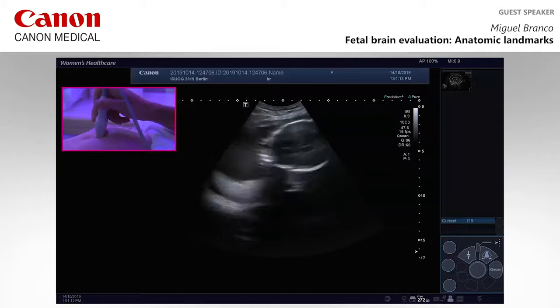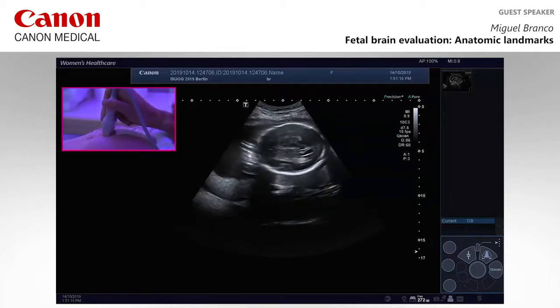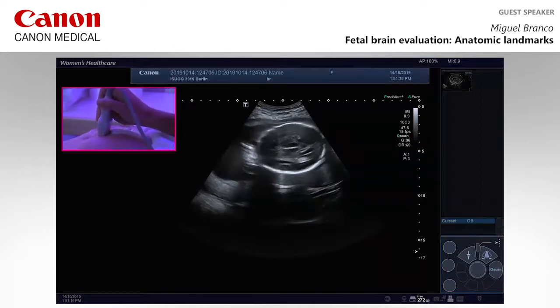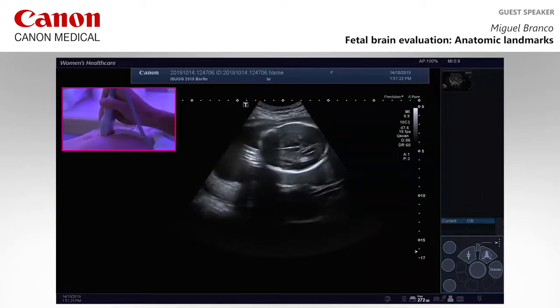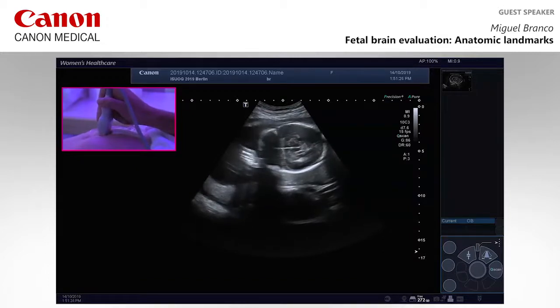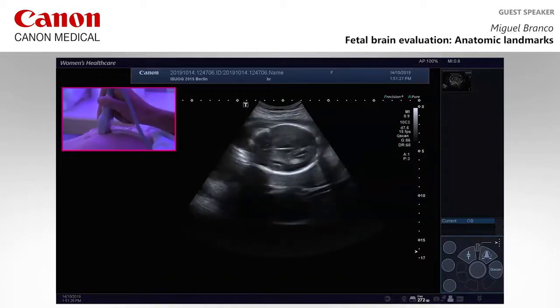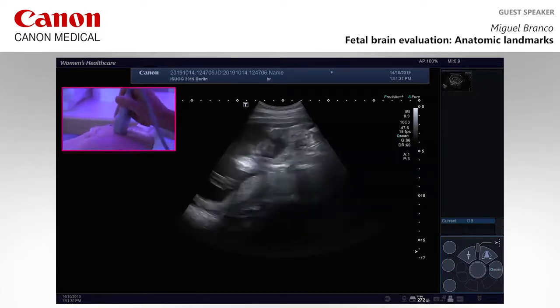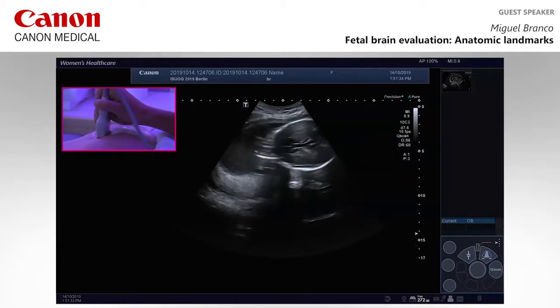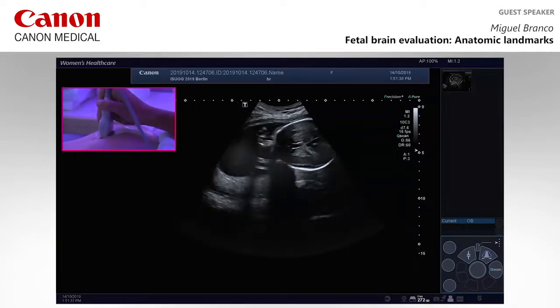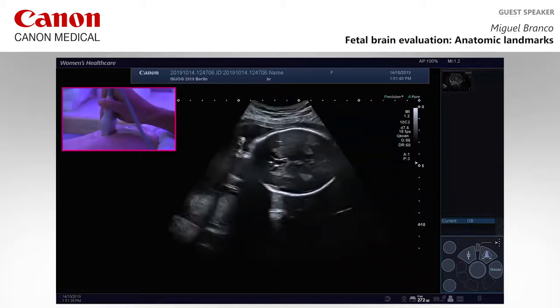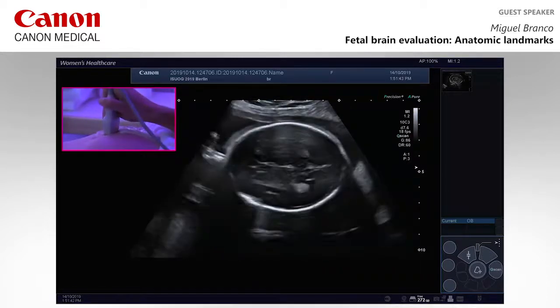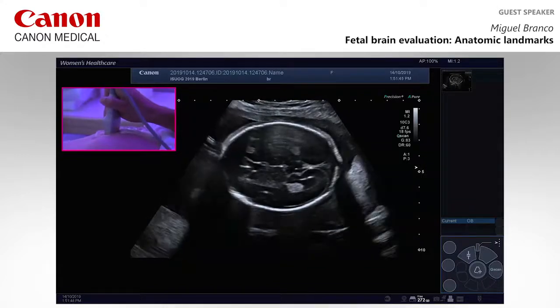We will start. I would like to imagine that every time we perform a brain evaluation, we have to be as strict as a nuchal scan. Sometimes we have images that are too small with the focus not in place. So the first advice is: try to get a good image, good magnification, and the focus well in place.